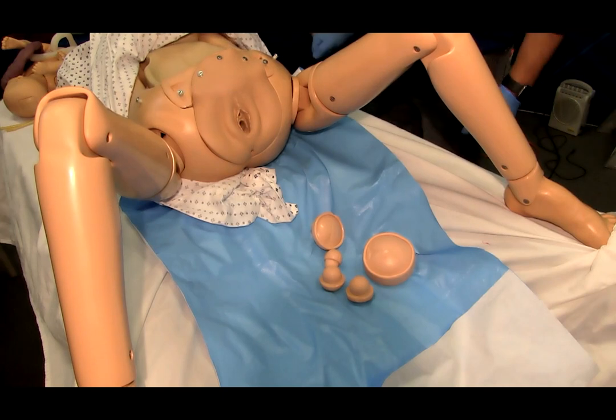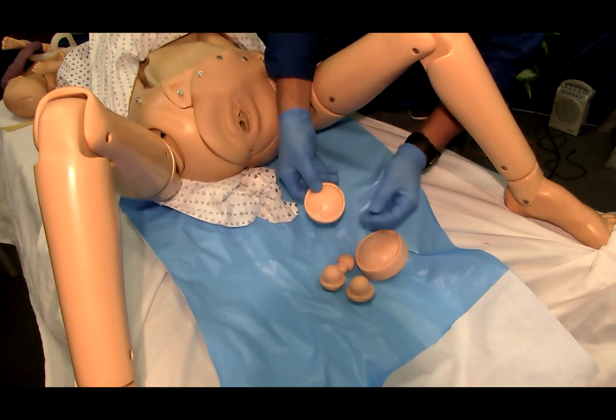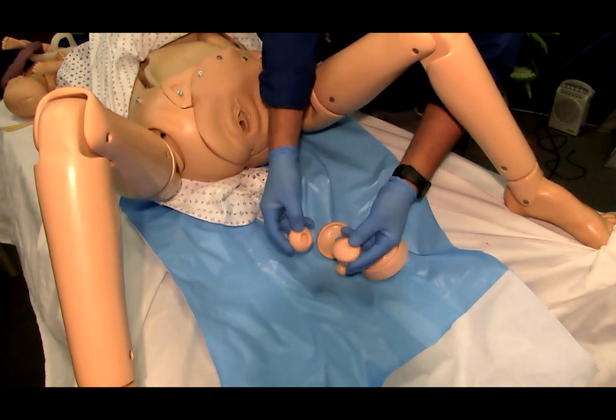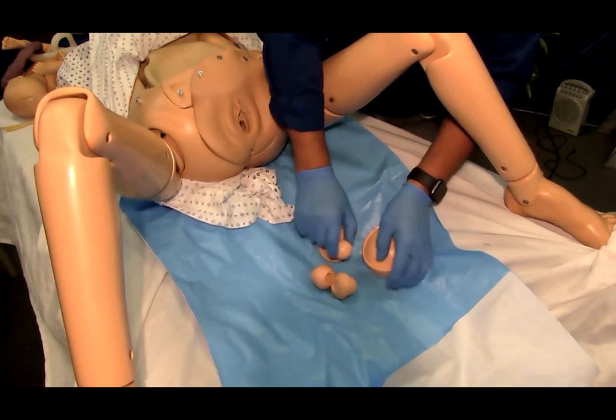With the detail of each cervical stage, cervical dilation examination can easily be taught in a simulation setting and for institutional procedures for checking cervical dilation.